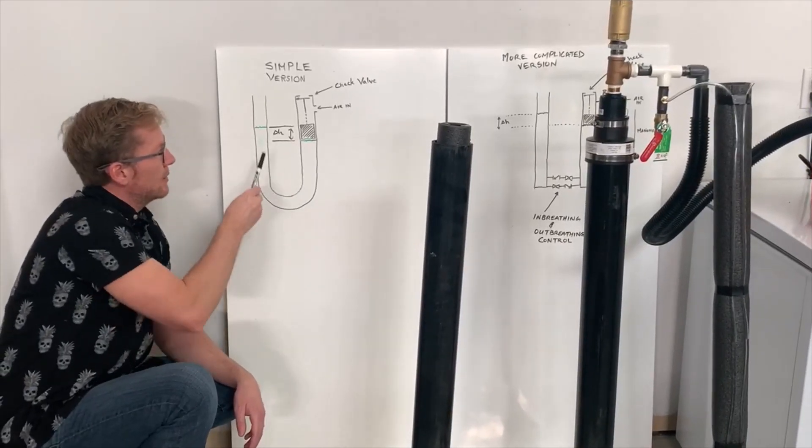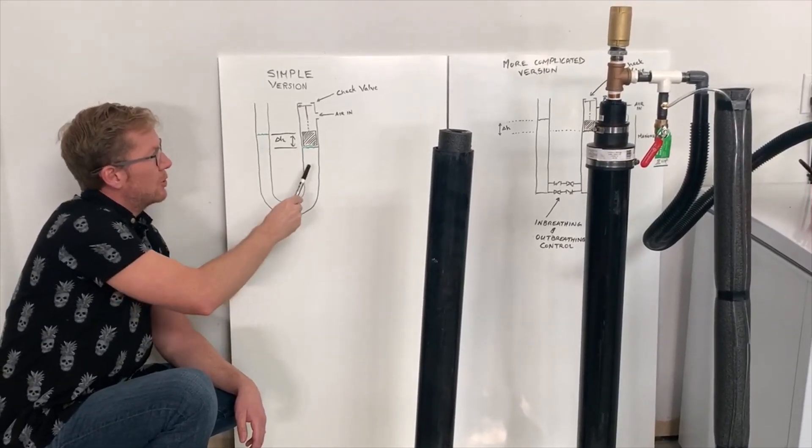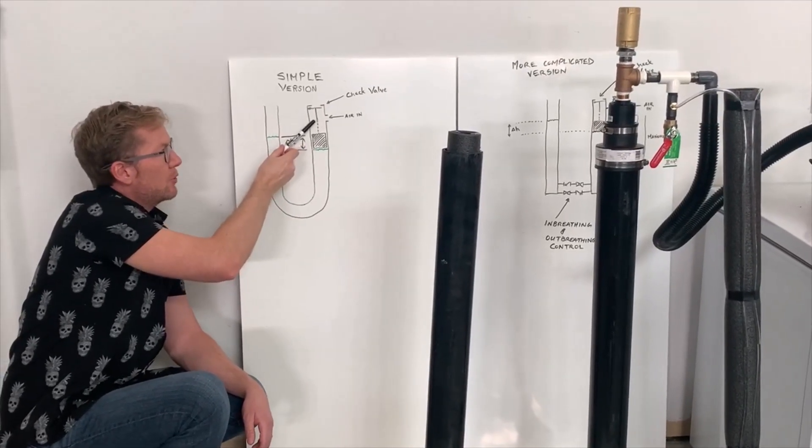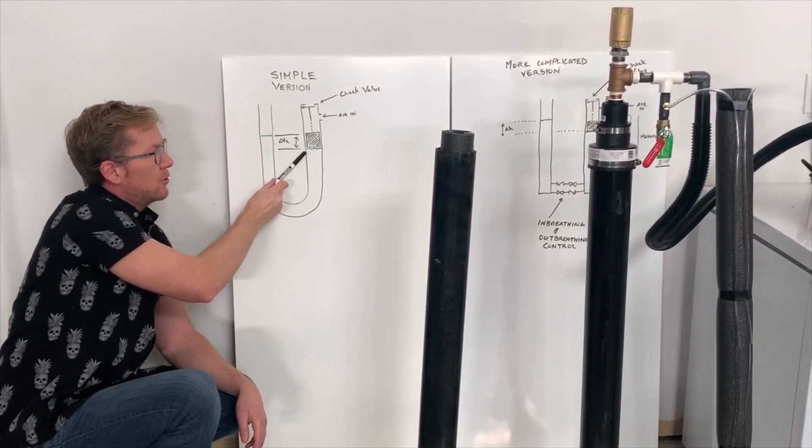The way this design essentially works is it's a U-tube partially filled with water, a check valve on one side of the U-tube with a push rod and a short length of chain attached to a float.